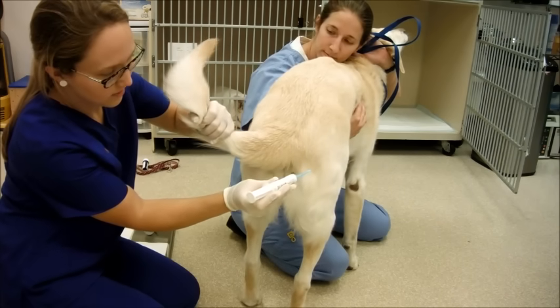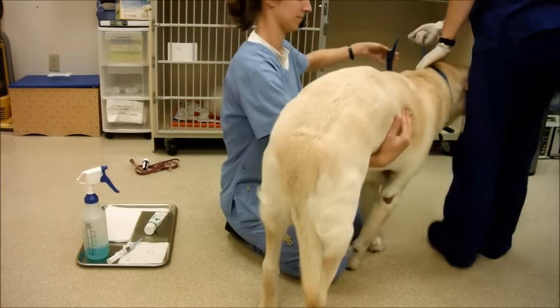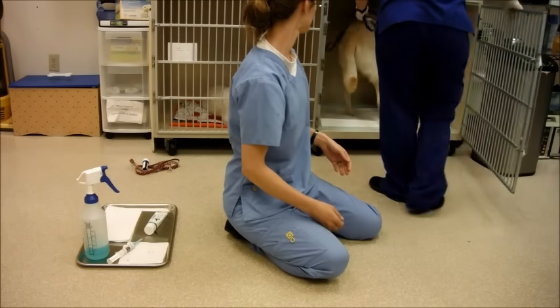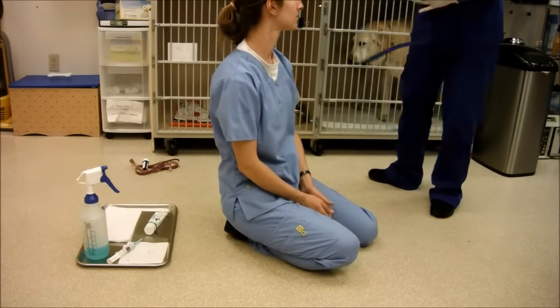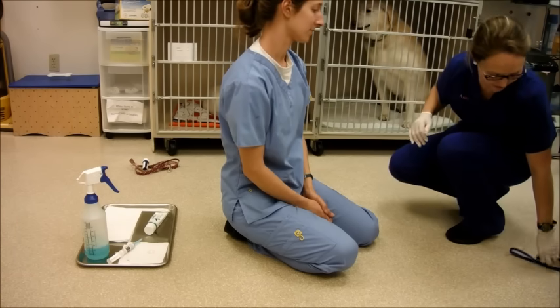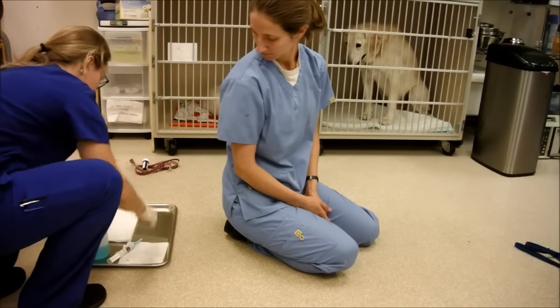As soon as I'm finished giving it, I take out the plunger, put it down, and then we would direct him right into the cage because this is going to act quickly. I would take the leash off, close the cage, and give him as much time as he needs to evacuate. I'm just going to wait a couple minutes for simulation purposes and clean up over here, put some of my stuff away.